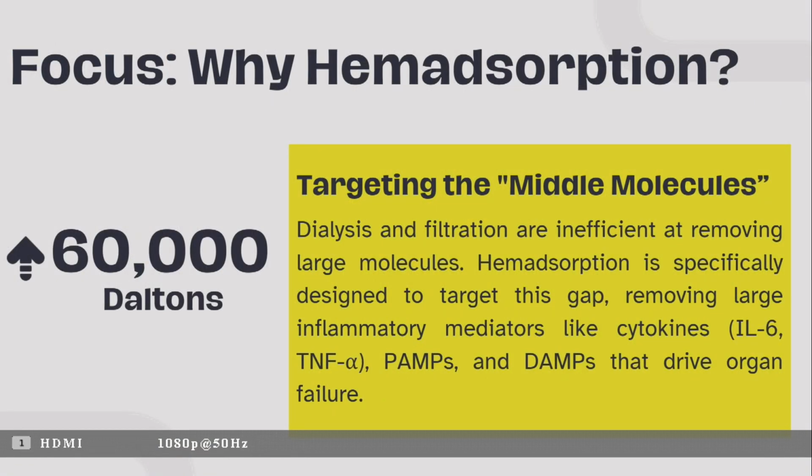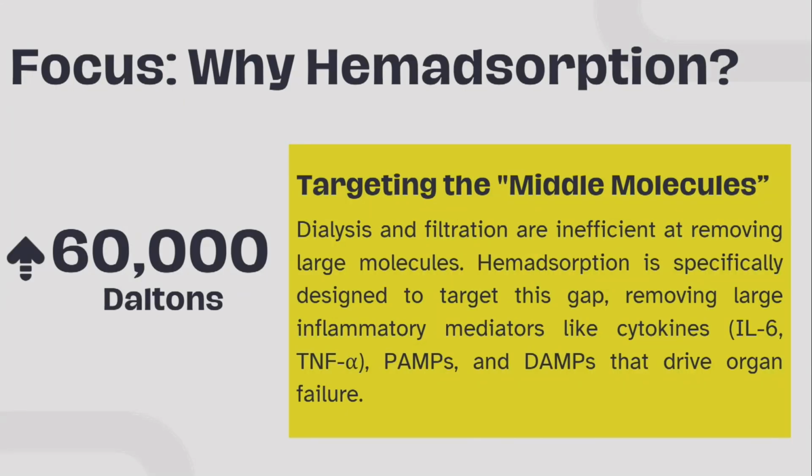Because there is a gap in the molecular weight where we can clear the blood of toxic substances. We saw we can clear up to 1500 Daltons with dialysis, up to say 30,000 Daltons with hemofiltration. But when it comes to a molecular weight nearing albumin, which is the maximum molecular weight that passes through the glomerular filtration barrier, that is the gap where we cannot clear the blood of albumin bound or protein bound substances. But we can do that.